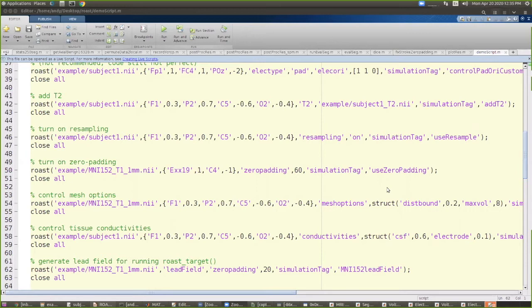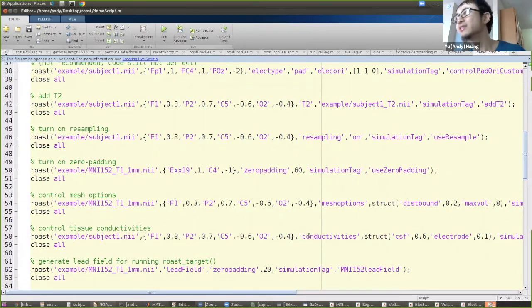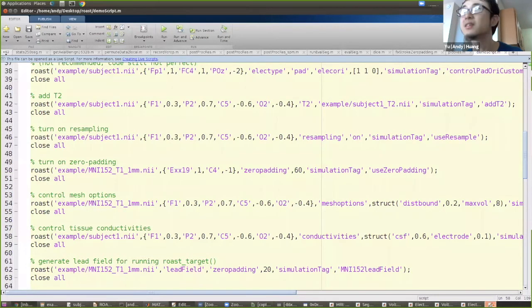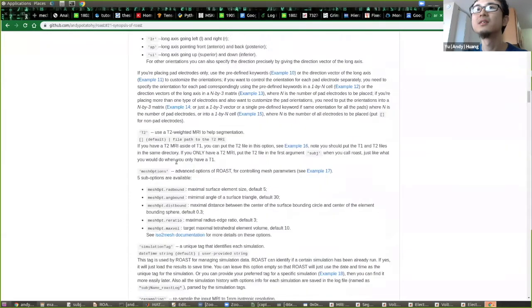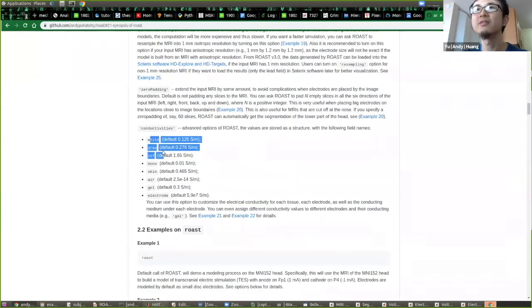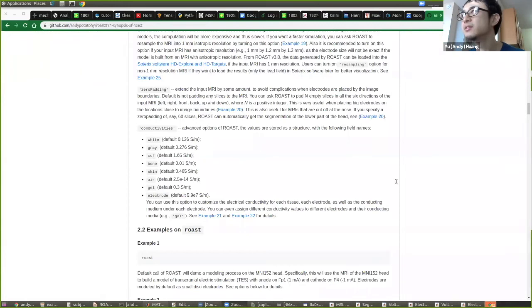On saline versus gel: you can control the conductivity of gel and saline using the conductivity option. The default gel conductivity is 0.3. On warnings about nodes not found when running ROAST: don't worry about those — they come from the GetDP solver indicating minor numerical instability, which is totally fine. By default, gel is modeled underneath the electrode.